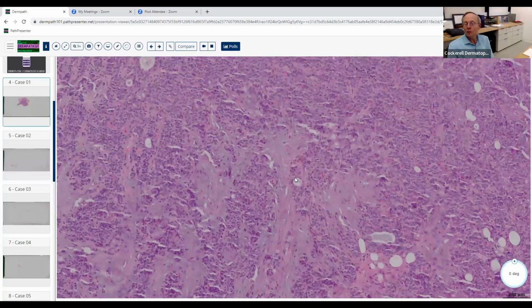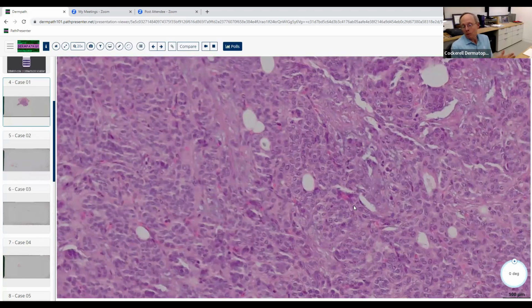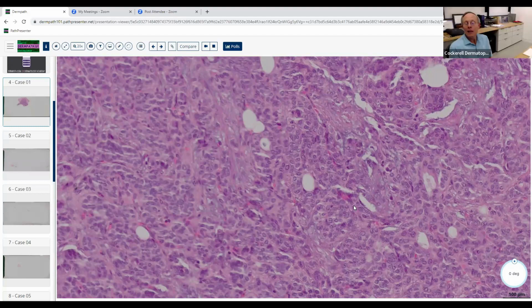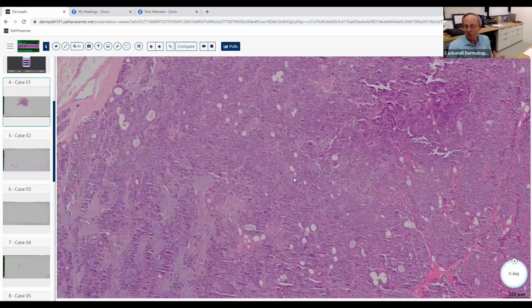Now you said you knew the diagnosis, syringoma. You knew this answer. So go backwards. If it's chondroid, you saw that part. If it's syringoma, what kind of differentiation is a syringoma? That part would be the epithelial part. But what part of the epithelium? The sweat glands, the eccrine sweat unit. So that's thought to be eccrine differentiation. So if it's chondroid syringoma, this is the eccrine syringoma part of it, if you will. The other name for that is mixed tumor of the skin.